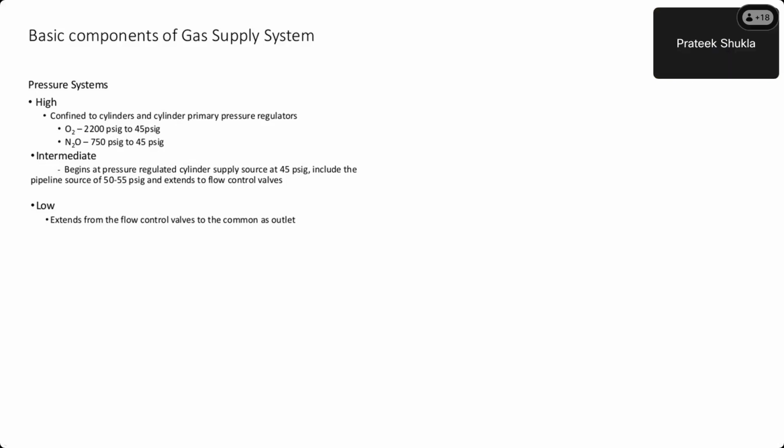Excellent. So there is a pressure gradient required. When it is 2200, it is more than 15, so it keeps getting delivered. When the gauge comes to 0, the atmospheric pressure is 15 and the cylinder inside pressure is also 15. I mean, the gas that is there is also at 15 psi pressure. So there is no gradient, so it cannot come out. So how can you get that gas out?